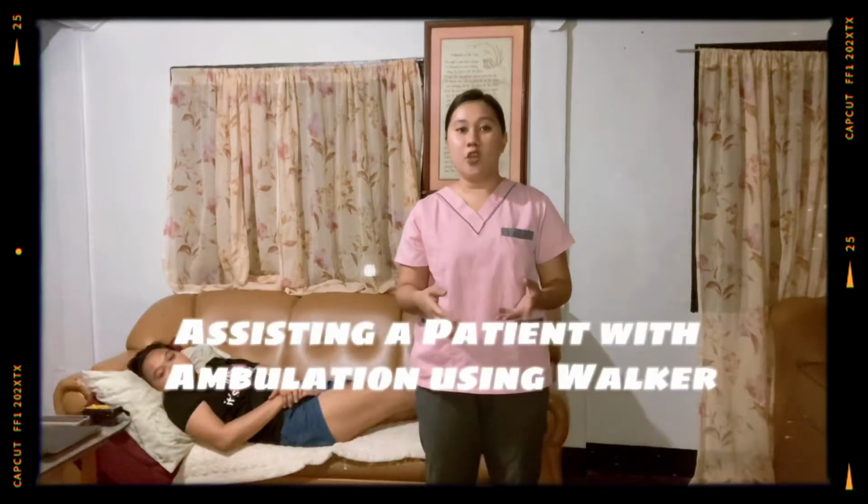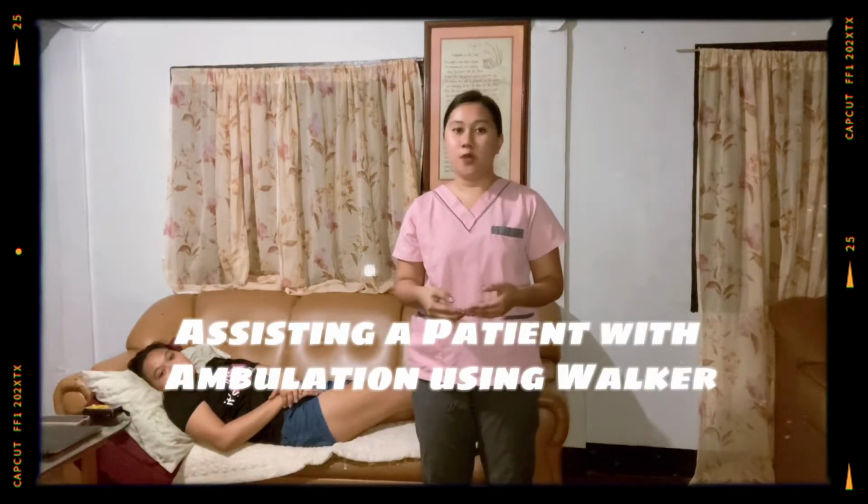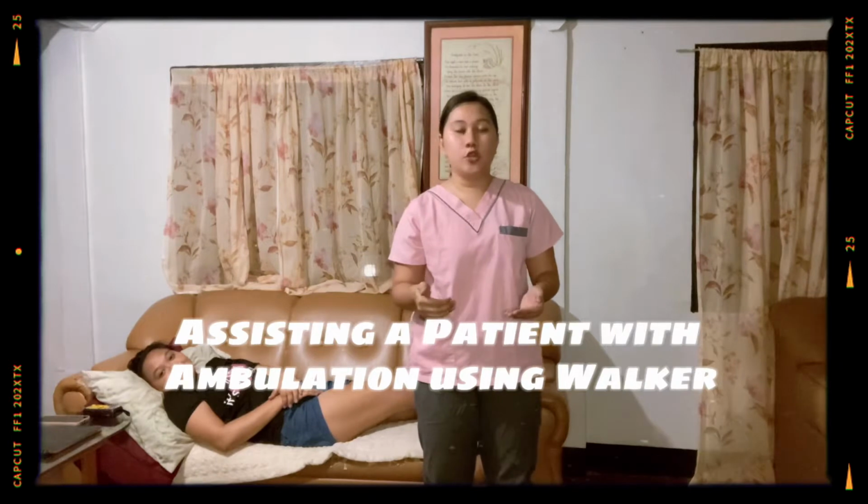Today I am going to demonstrate to you the procedure for assisting with ambulation using a walker. But before that, we are going to do an assessment, which is to assess the patient's ability to walk and the need for assistance, and to assess the patient's pain before the time of the activity, and also assess the patient's knowledge regarding the use of a walker. So since we are all set, we are going to start the procedure.